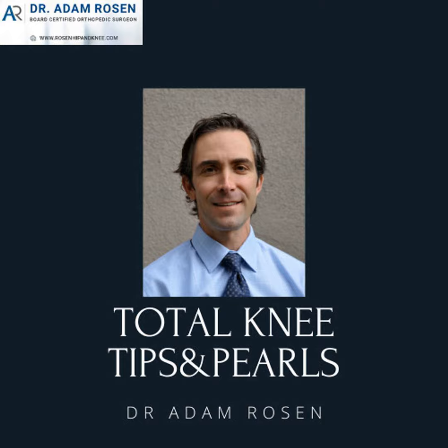So those are all things that you want to use as verbiage, as opposed to going, as a 76-year-old person, they have bad arthritis. That's what we get sometimes, and is they have a fracture of their hip. Okay, where and what kind?